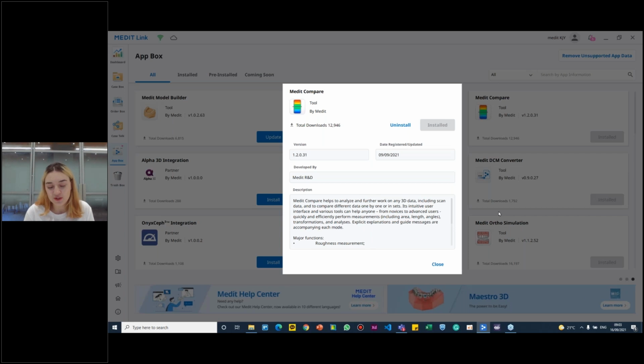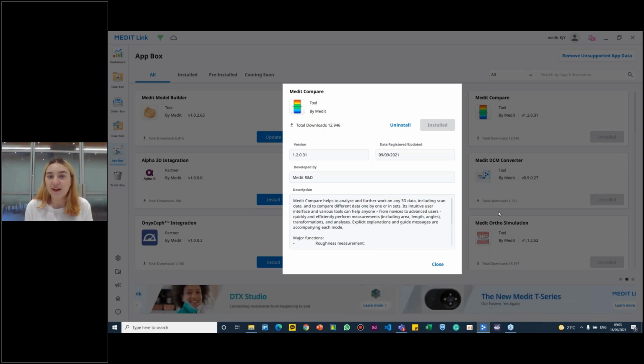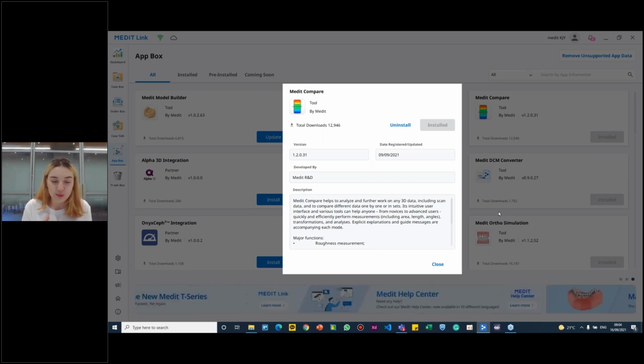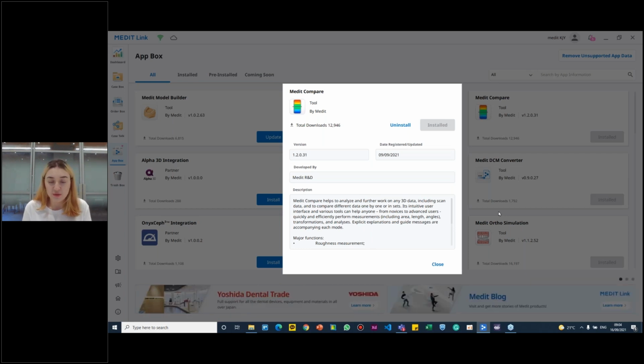And the features that we introduced in this update, I think the major one, which is mesh editing, data sculpting, is something that a lot of users have been asking for. I just searched our user Facebook group for all of those requests. There are so many. So of course, when we have so many of those requests, we try our best to incorporate and find a way to provide it.